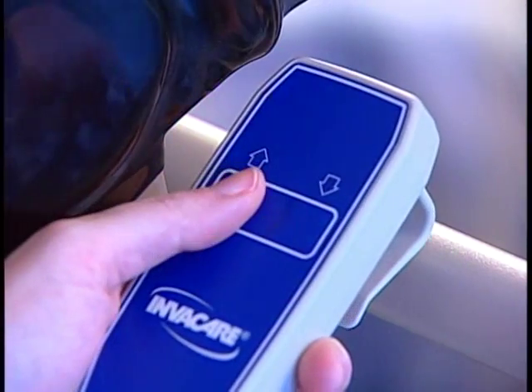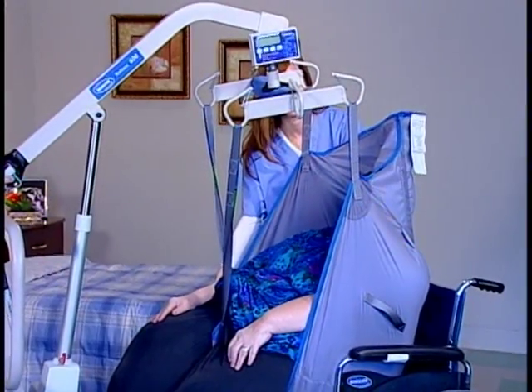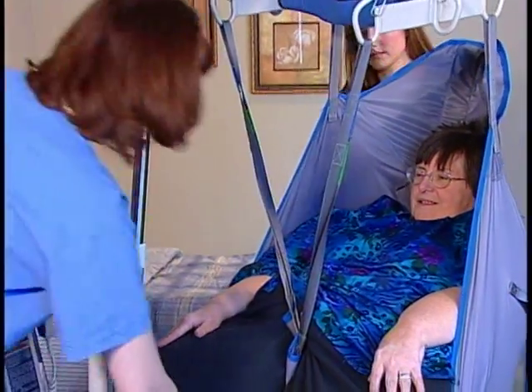Start the transfer. Press the up button on the hand pendant until the resident rises to a point just above the wheelchair. During the transfer, the other caregiver can use the sling handles to maneuver the resident.